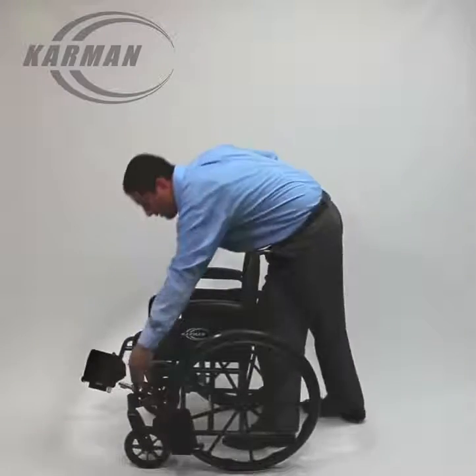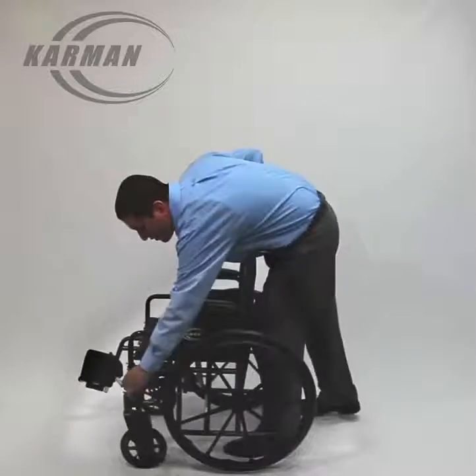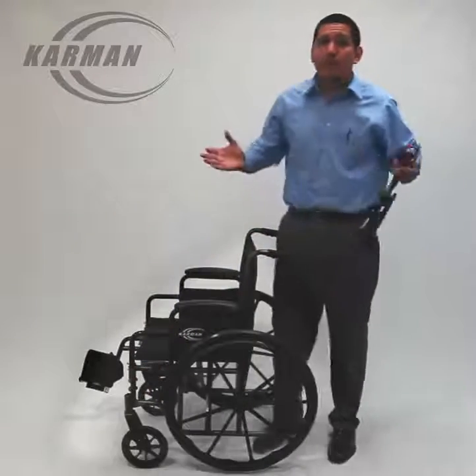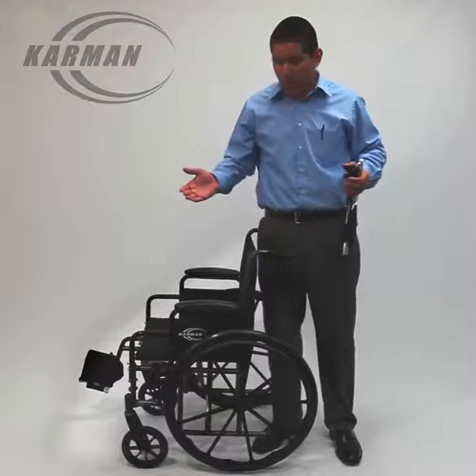Removable footrests — push of a tab and they swing out. You're able to remove them just the same way, which makes it easier to fold up. Put it in the back of a trunk, put it in the back of a car, and it's that simple — you're ready to go.